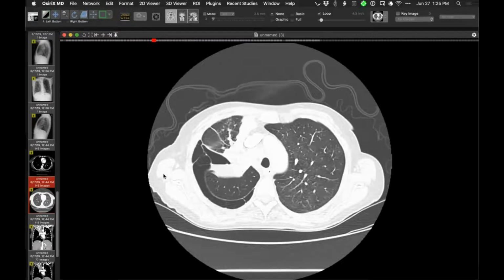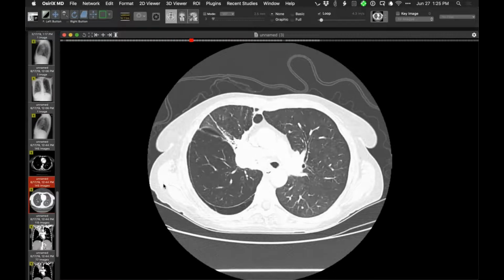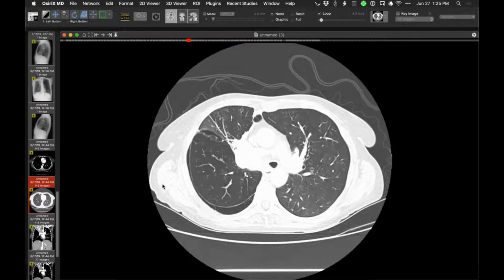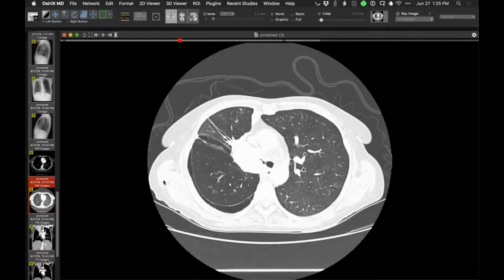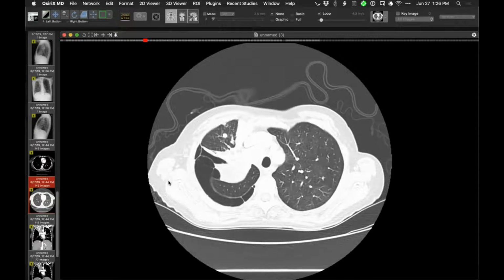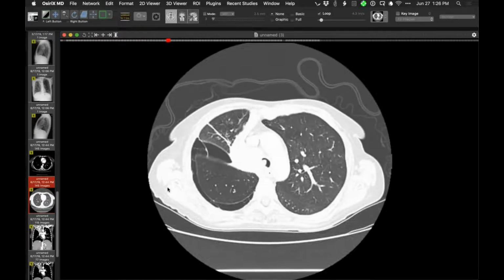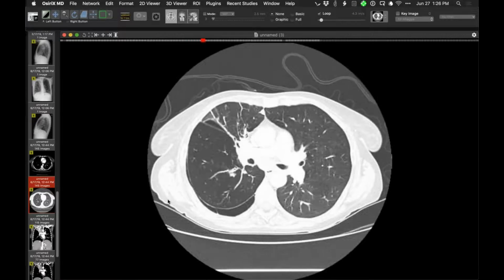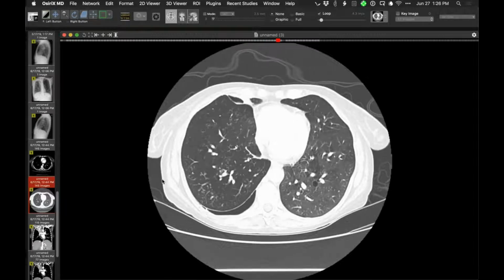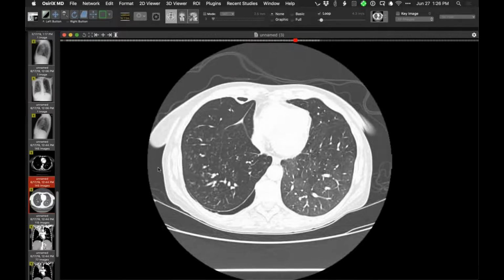But the classic description was from the Journal of Thoracic Imaging, describing obstructive atelectasis with pneumothorax ex vacuo. I'm not quite sure exactly why that happens, but I think that's undoubtedly what that is. So I'll send along that classic article from the JTI, and they described a couple of cases of that.